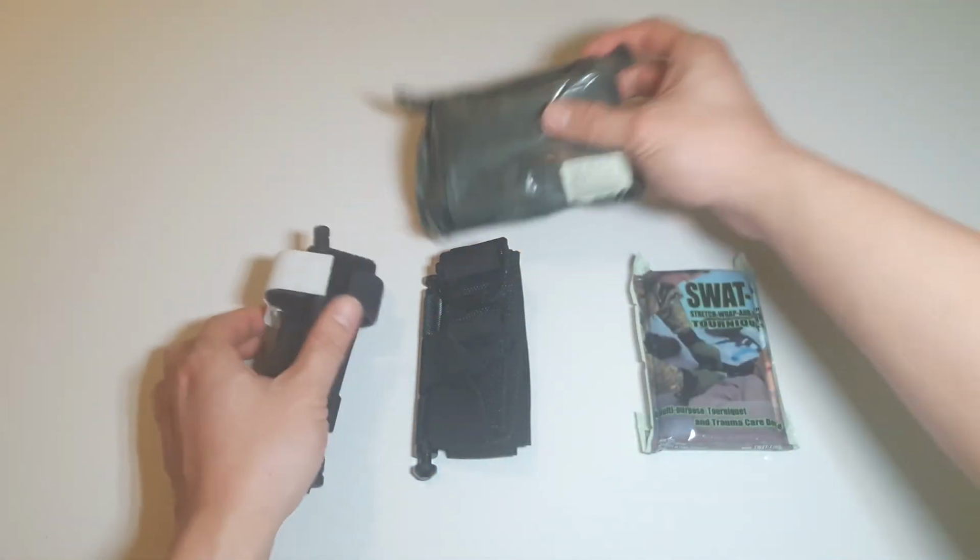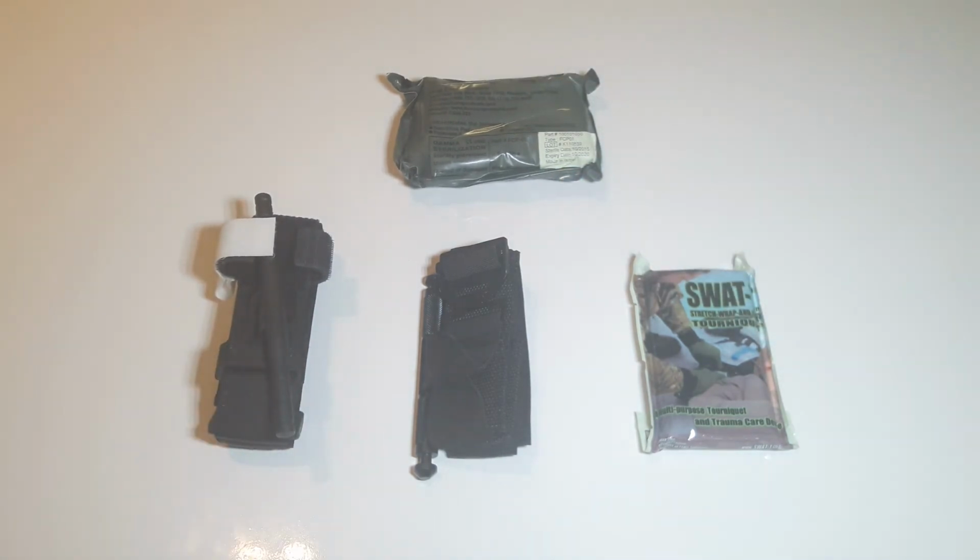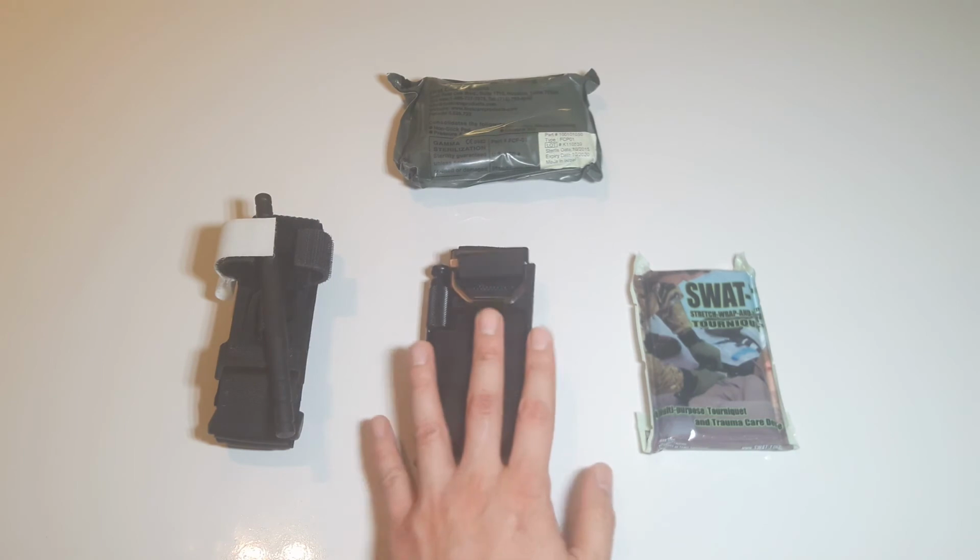What you do is wrap it like you would a pressure bandage, but instead of clipping the end using the plastic clip, you place 1 or 2 wraps above the plastic clip and use it like a windlass. Tighten until the bleeding stops, then clip it to itself to prevent it from unraveling.